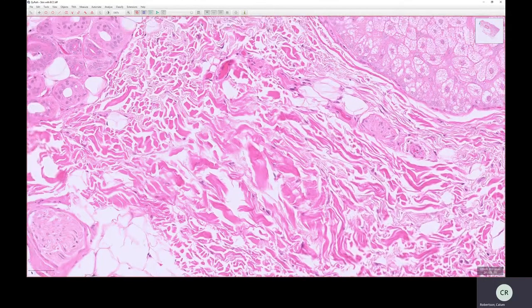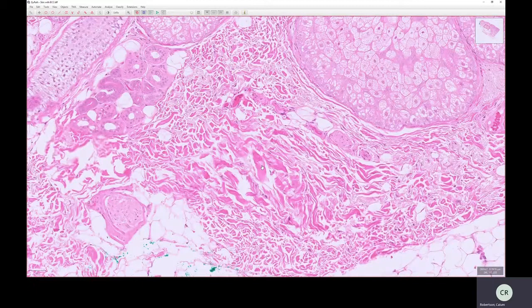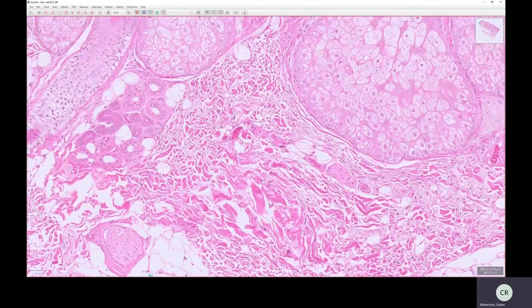These are more collagen fibrils here. And collagen is not intracellular, it's extracellular material. It's maintained by cells, but it's not within a cell. It's not living tissue per se itself. And that's collagen. And there are different types of collagen. This is type 1 collagen because it's within skin.